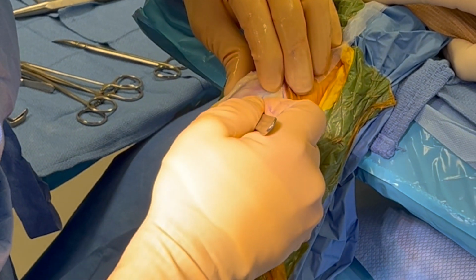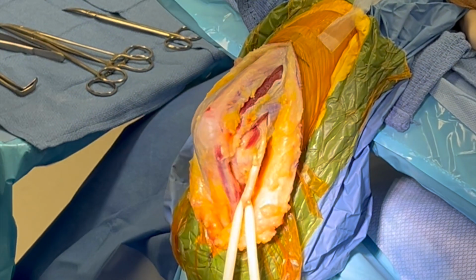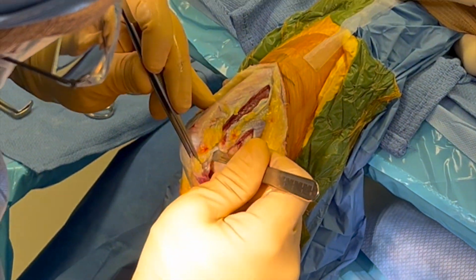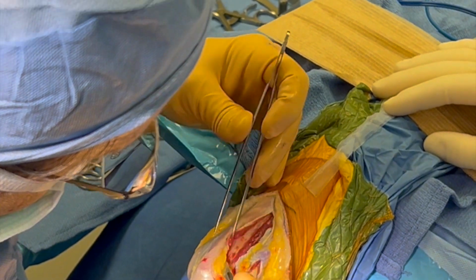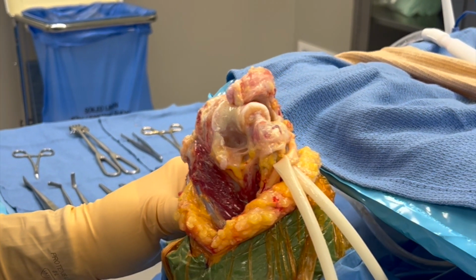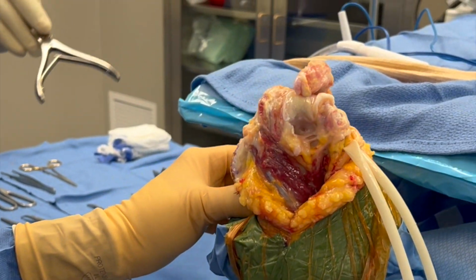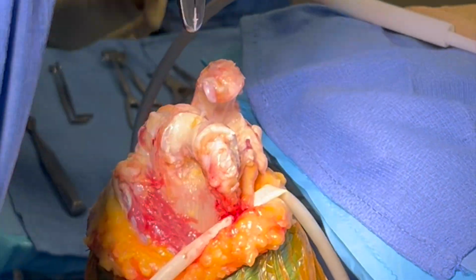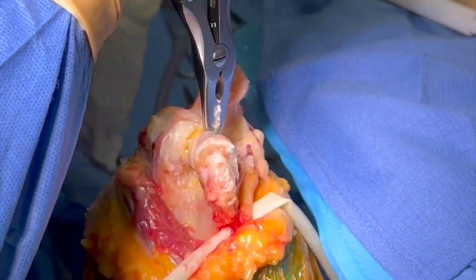Next, the triceps is dissected off of its insertion over the proximal ulna and reflected from a medial to radial direction. Care is taken to take a full thickness of the triceps. Once the triceps and the collateral ligaments are resected, the elbow can be dislocated with hyperflexion.